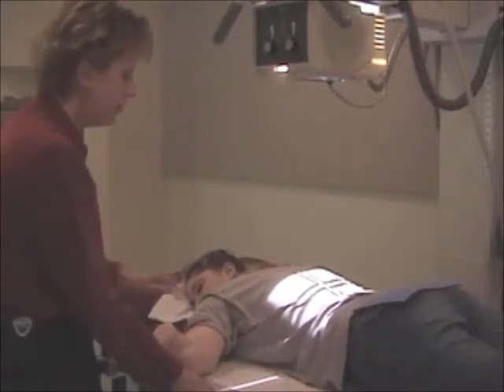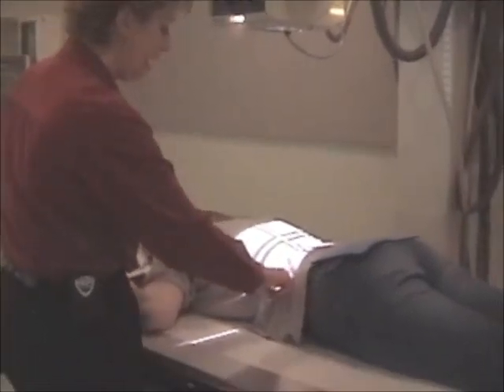Now if she's underweight, you would take the iliac crest, tip of the scapula, go halfway as your baseline, and then you would drop down 1 inch for the hypo. And if she was asthenic, that's even tinier, the stomach drops even more, you're going to be 2 inches below. Okay? Again, don't x-ray tabletop, the side-to-side method.